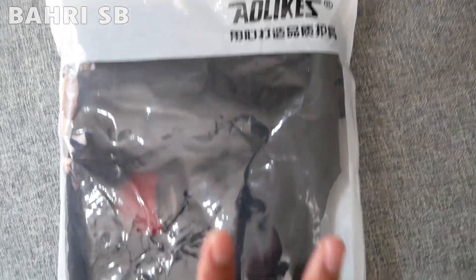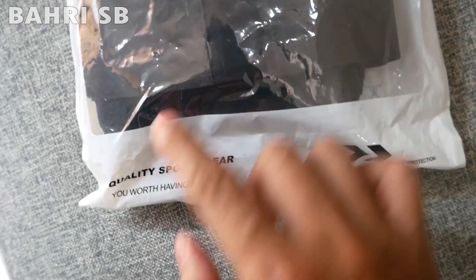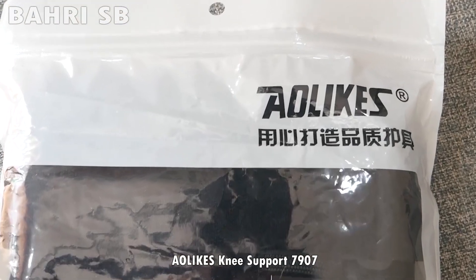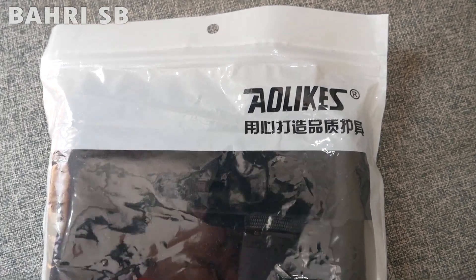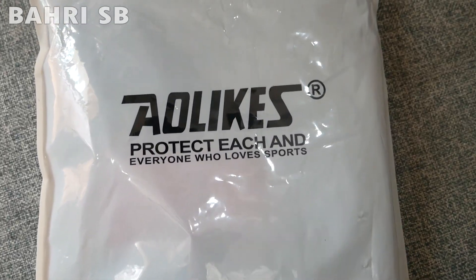Hello friends, what's up? Kali ini saya akan review penyangga lutut atau knee support dari brand Owlikes, tipenya Owlikes 7907, gunanya untuk penyangga lutut atau pemulihan dari cedera lutut.